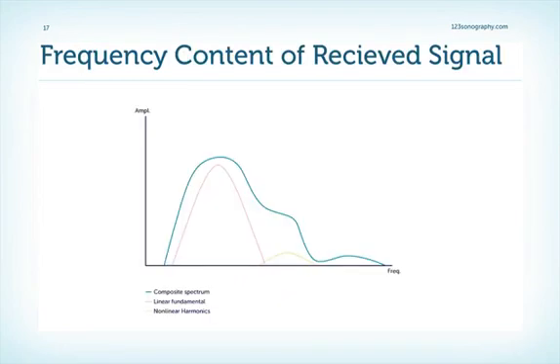Now I just briefly have to go back to the physics of ultrasound again. Remember I told you we're sending out a signal which has a certain frequency, and that pulse wave is reflected. What I haven't discussed yet is what the frequency of the return signal is. Well, the basic frequency of the return signal is the same as the one that is sent out, but not entirely.